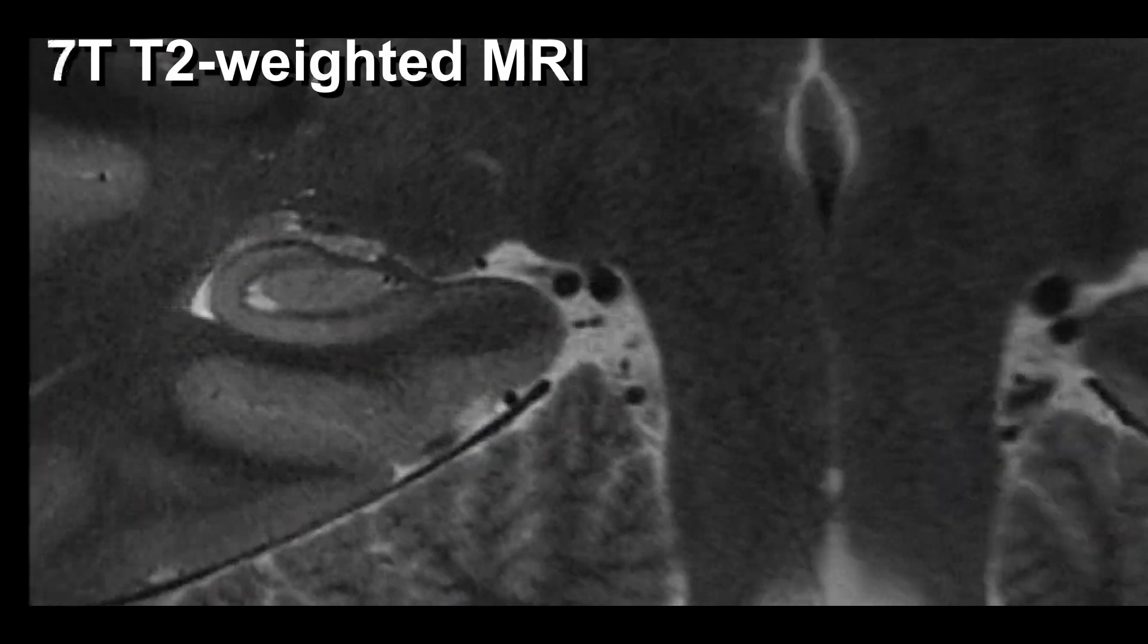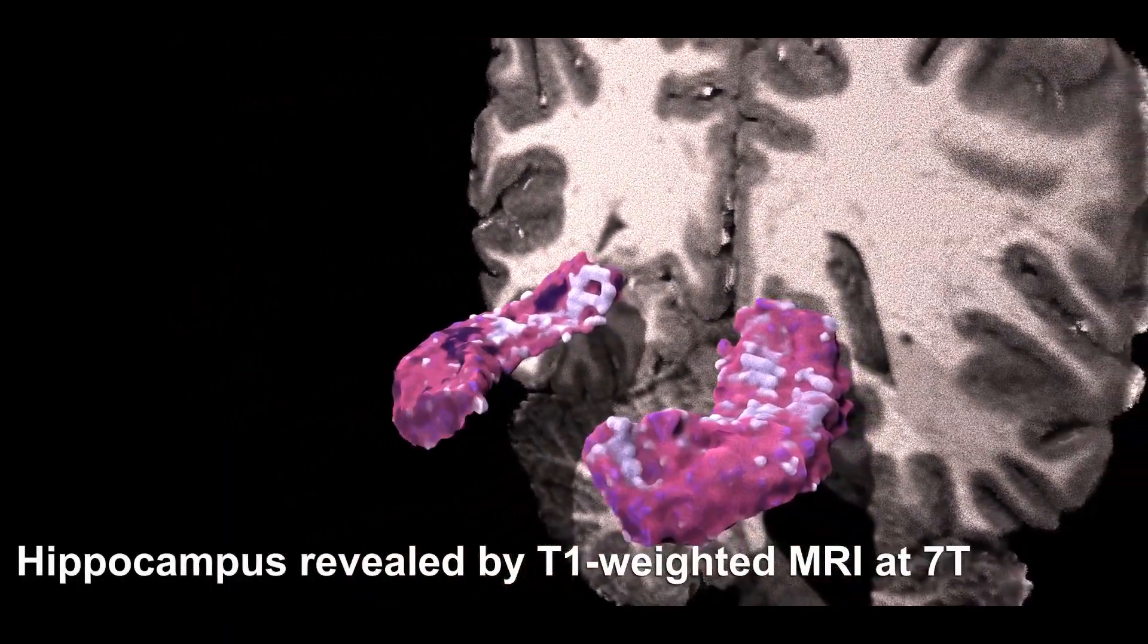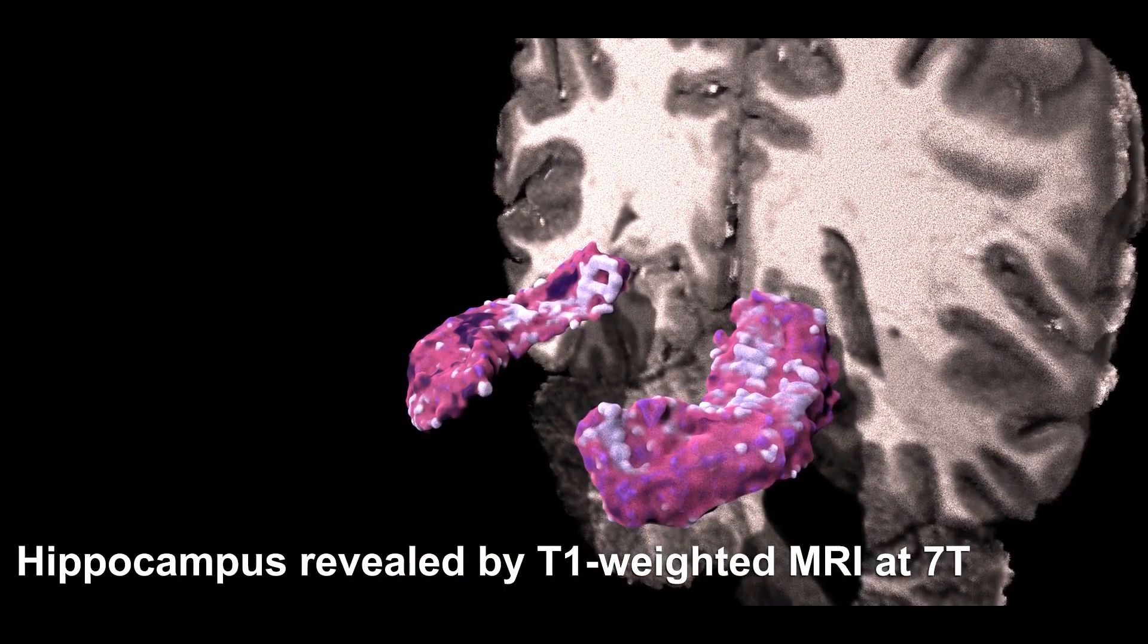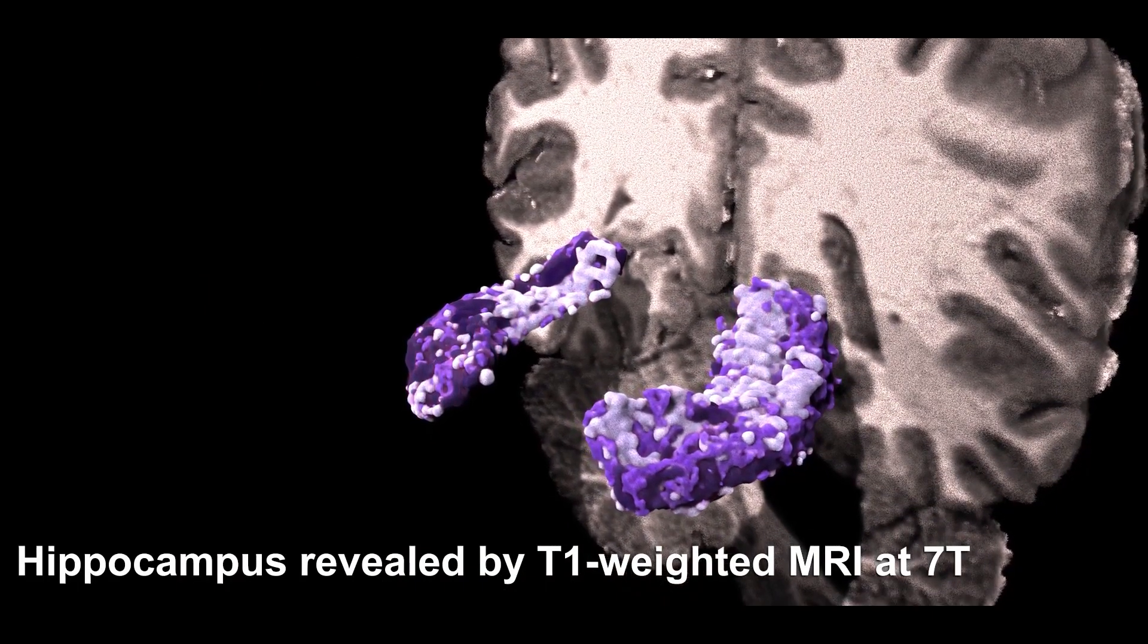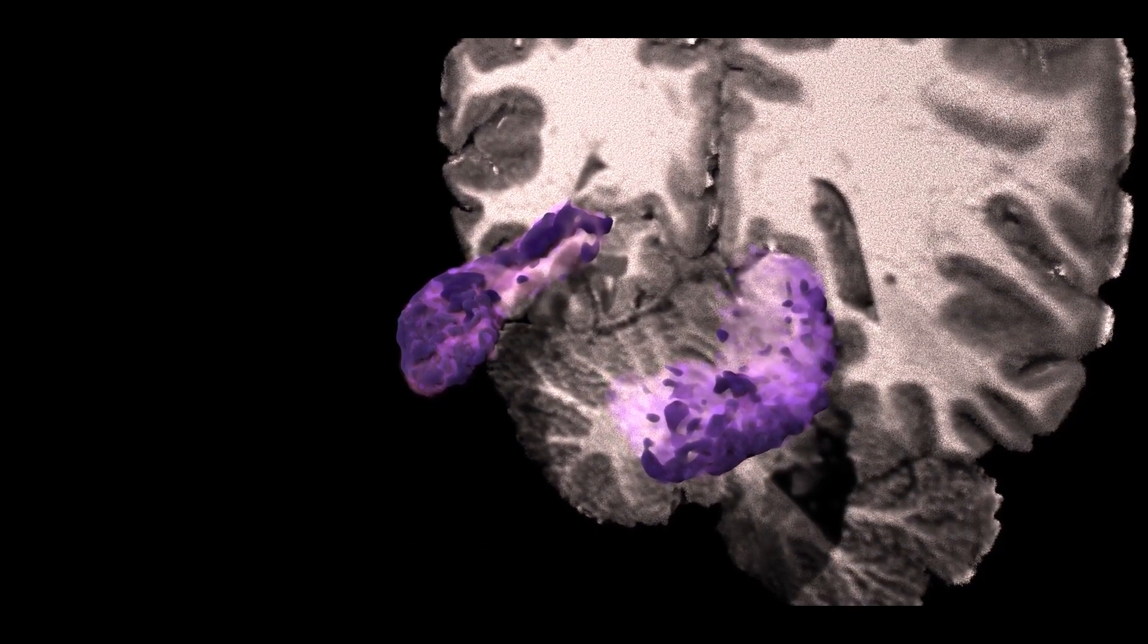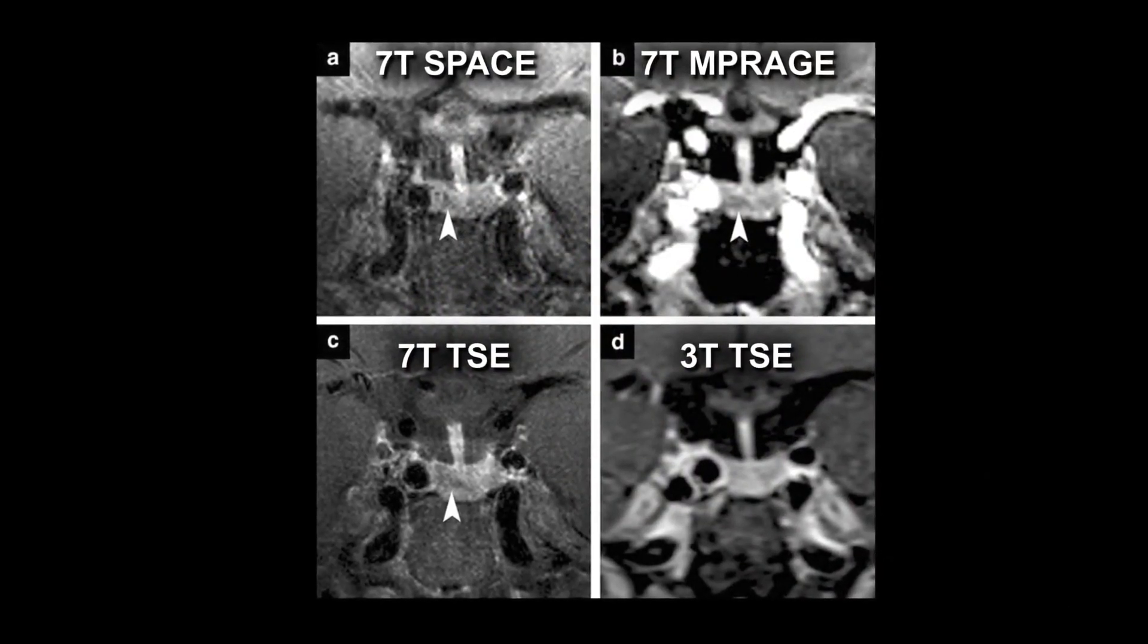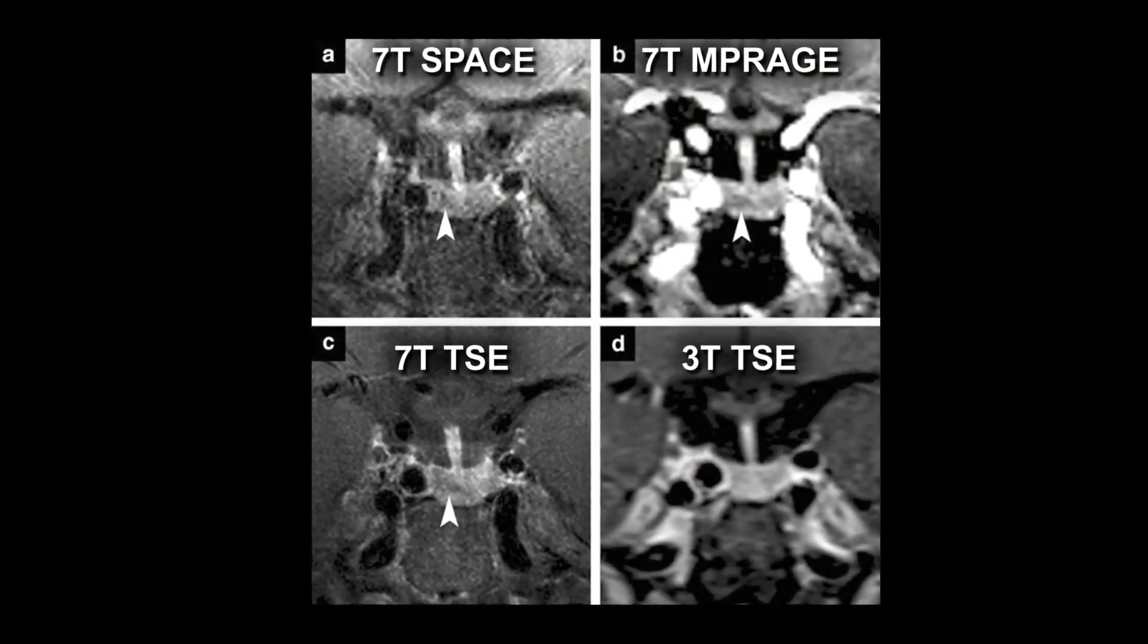For example, nerve scientists can discover numerous subfields of the hippocampus, a key structure damaged in aging and Alzheimer's disease. This new data can help doctors and researchers gain a clear understanding of how Alzheimer's disease affects the brain and allow them to design targeted treatments.